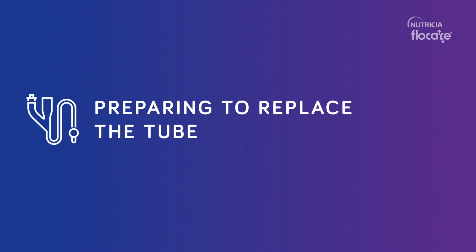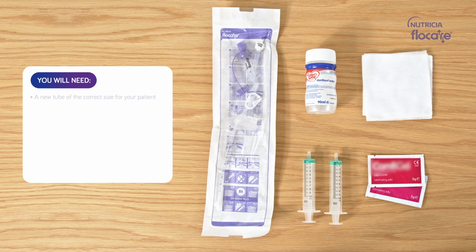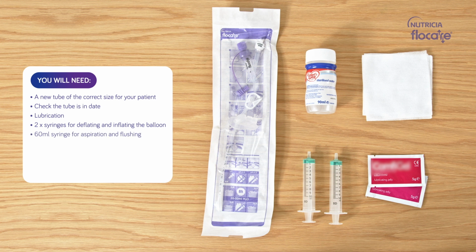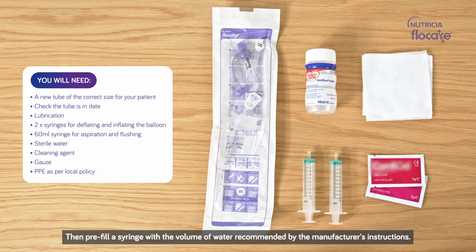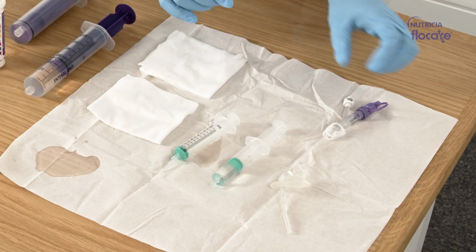Preparing to replace the tube. To prepare the equipment, you will need a new tube of the correct size for your patient. Check the tube is in date. You will also need lubrication, 2 syringes for deflating and inflating the balloon, a 60 ml syringe for aspiration and flushing, sterile water, cleaning agent, gauze, and PPE as per local policy. Then pre-fill a syringe with the volume of water recommended by the manufacturer's instructions.